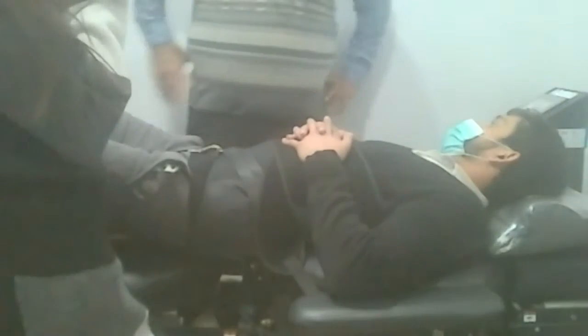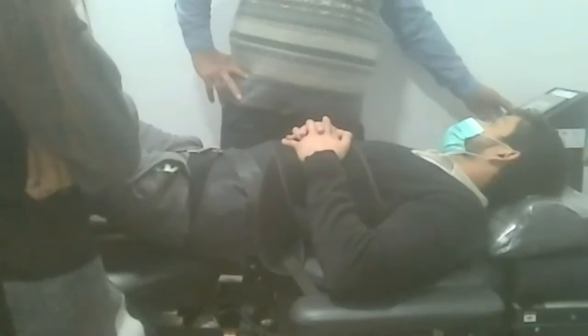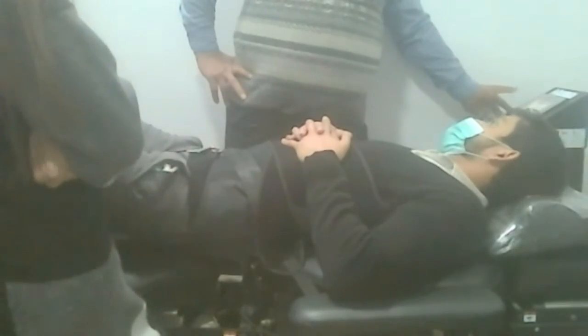All right, so let's go ahead and hit stop on the computer there. Now, it'll tell you on the computer screen, release the patient, then press to retract. So release the patient, meaning open up all the harnesses. Don't press that button yet.